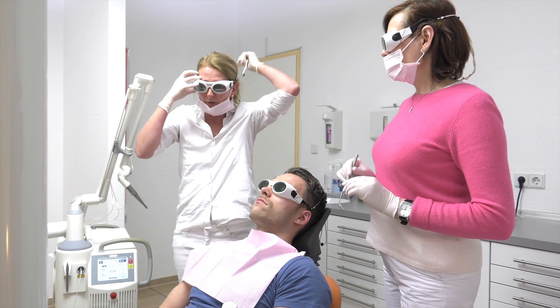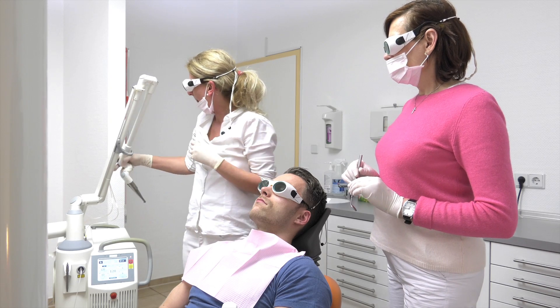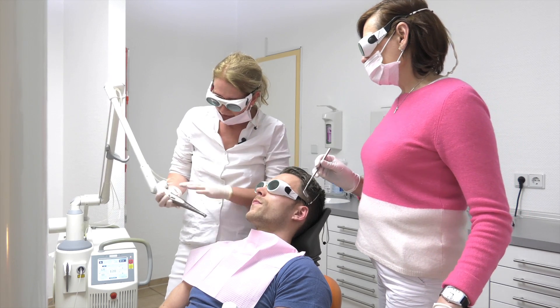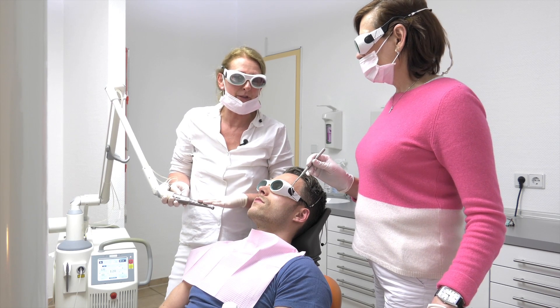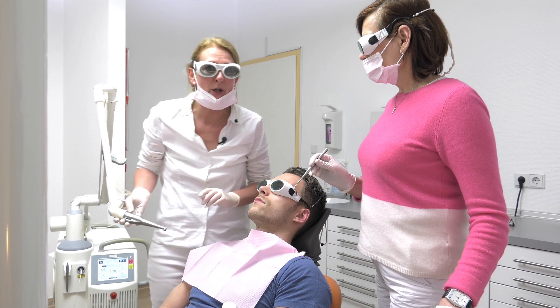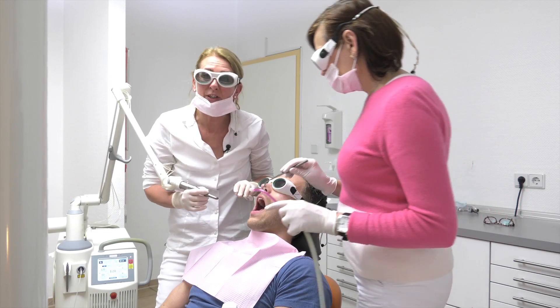Of course we do have to wear our laser safety glasses. And here's our laser — it's the Erbium YAG laser. The wavelength is at 2940 nanometers and you already know that the absorption is in water. So, just let us start.